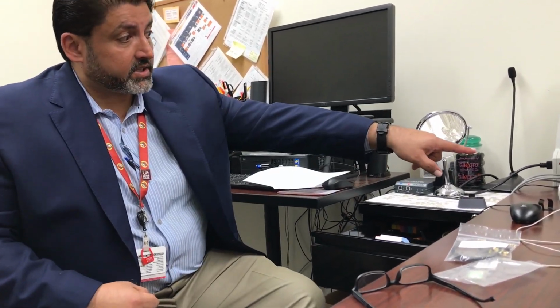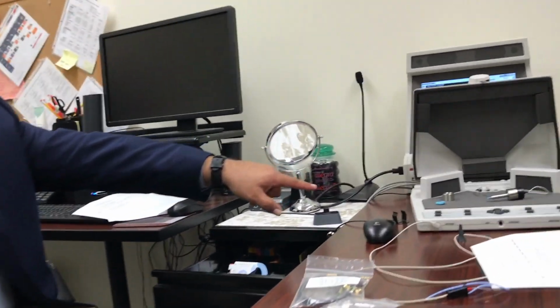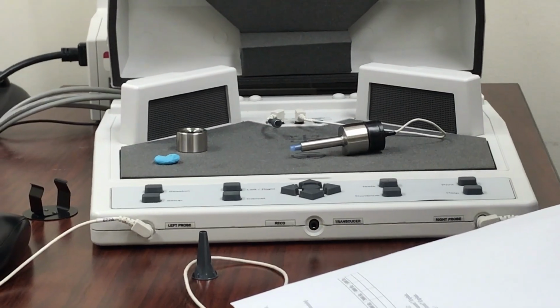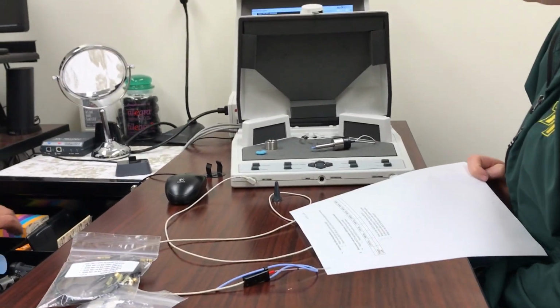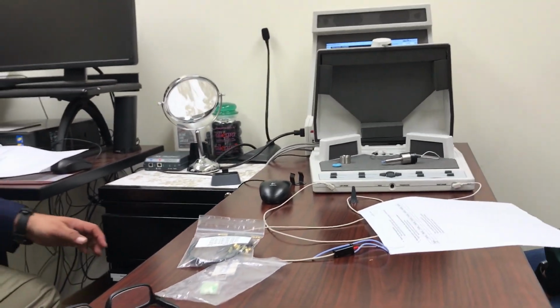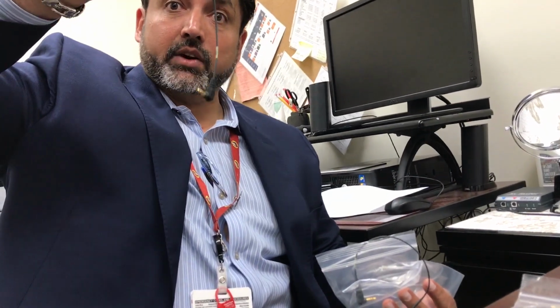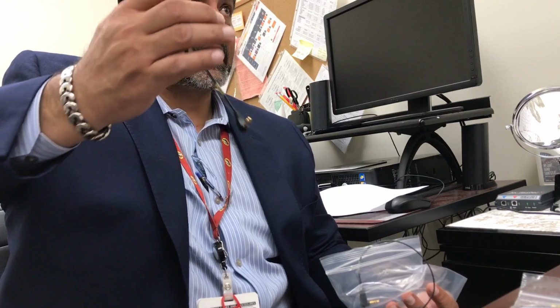That is not it. The ear plug goes in your ear, and what's the measurement? They'll put sound in it, the sound will be measured when it comes back out, and it will then compare that test to the test of the 2cc coupler that's here. It will subtract or add those differences, and that is called the real ear coupler difference. I need that piece.